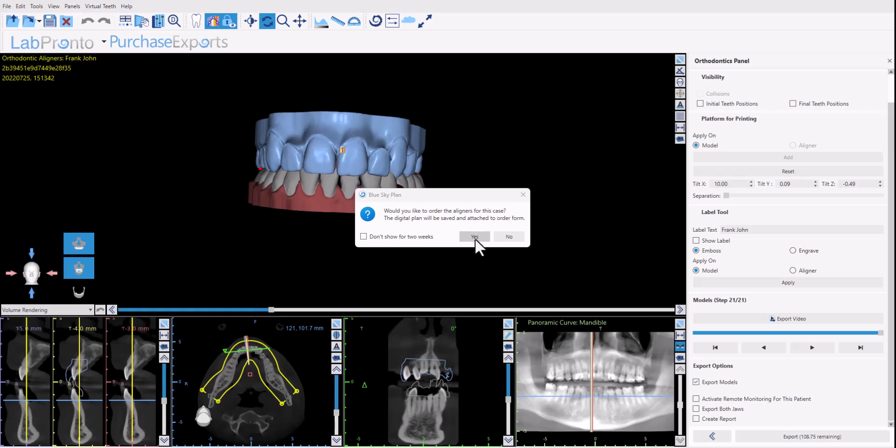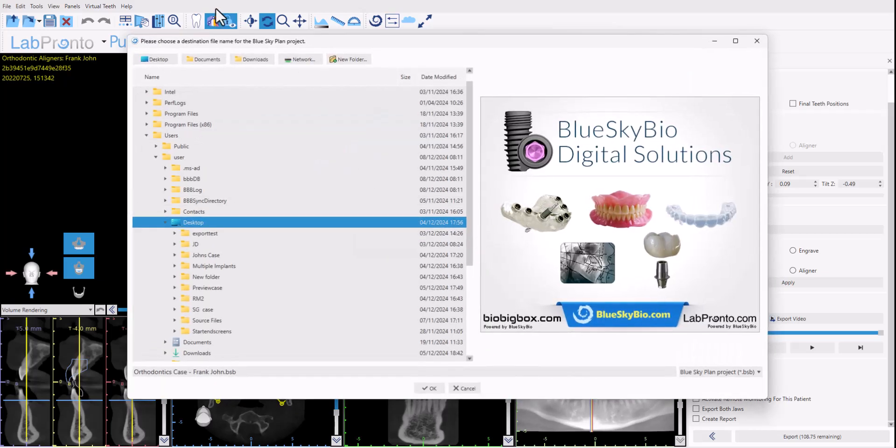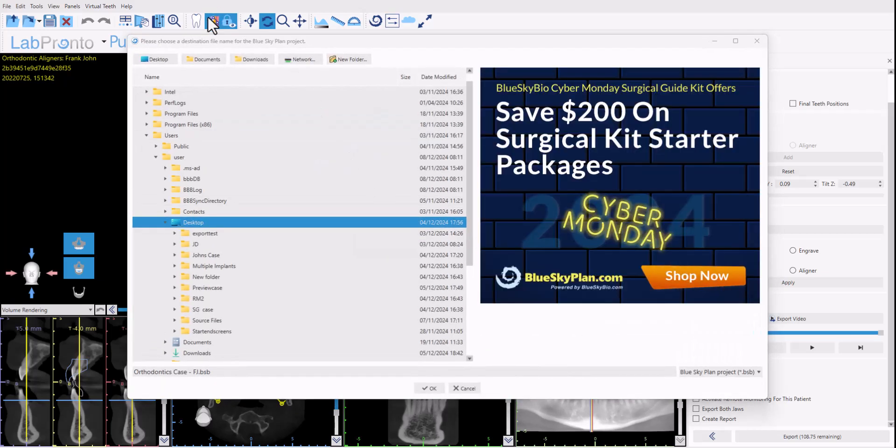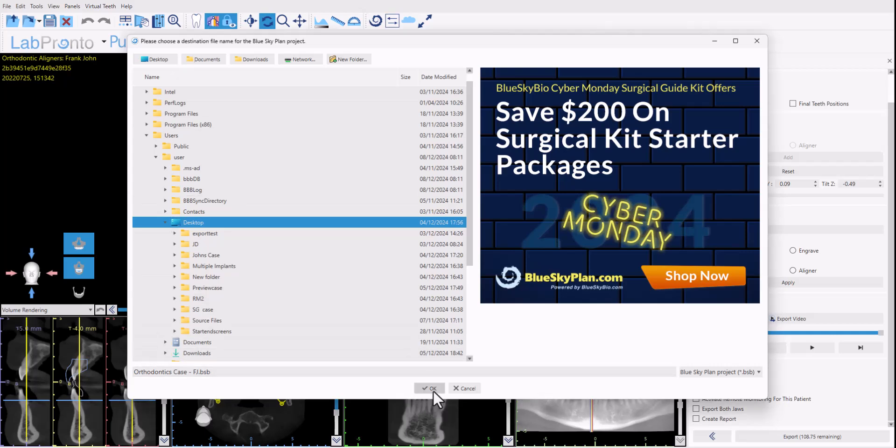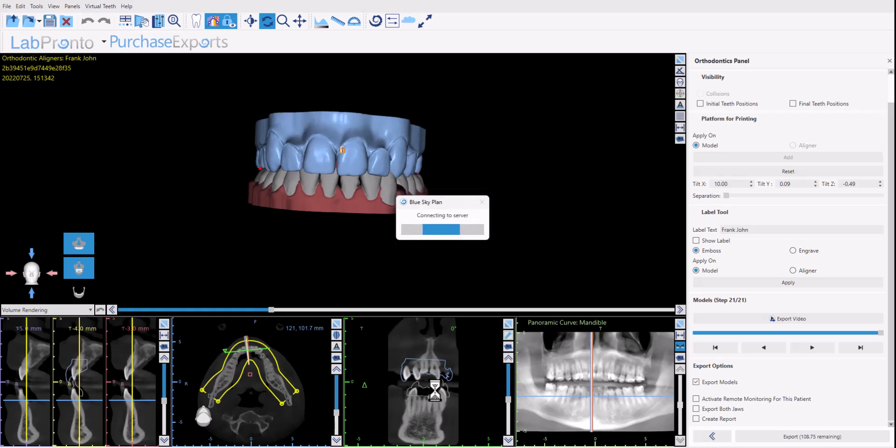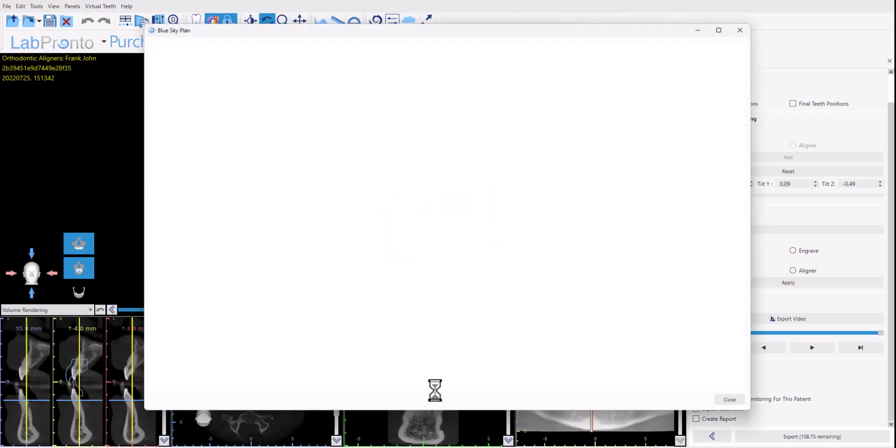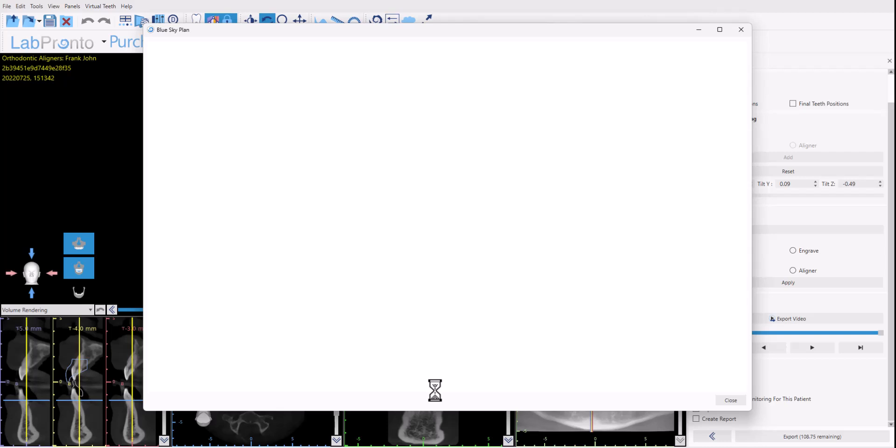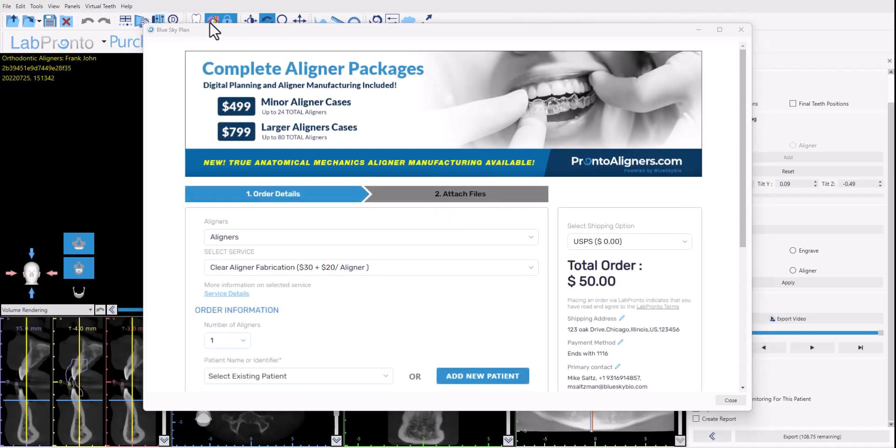And what will happen now is first the software will prompt you to save the case because you're going to be attaching the case that you just prepared and planned to the order form. The attachment is going to happen automatically. So the software is prompting you to first save the case and then the software opens up an order form. Again the data will be attached completely automatically and you can simply complete the order form to place the order for the aligners to be manufactured.